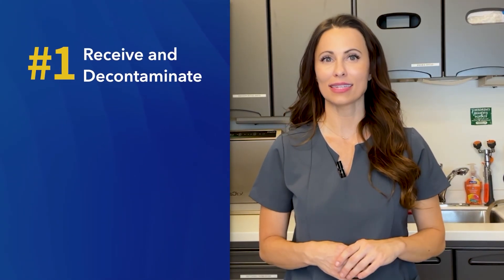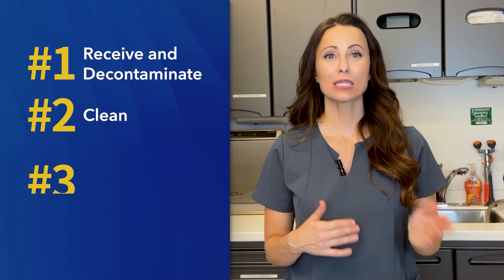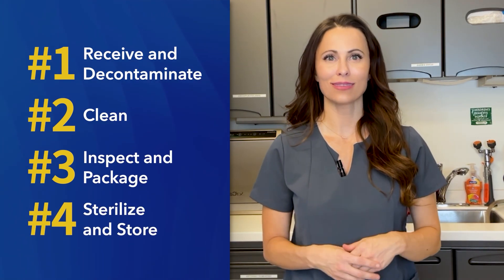We'll cover four main areas: receive and decontaminate, clean, inspect and package, and sterilize and store.